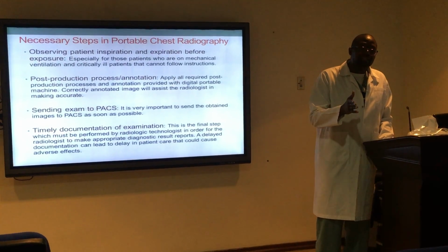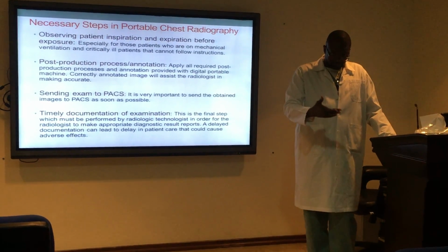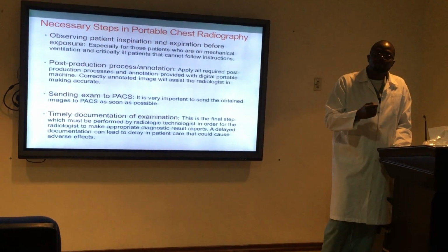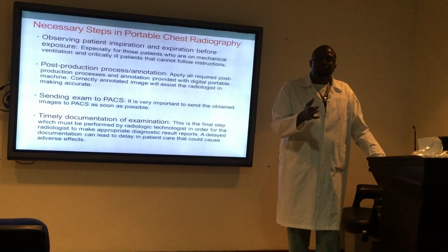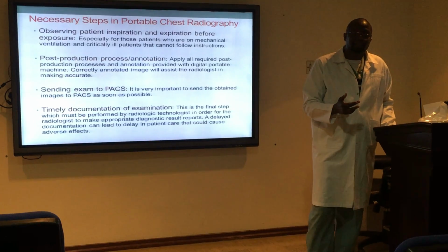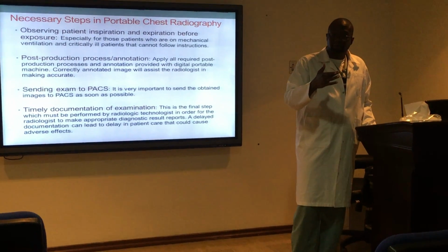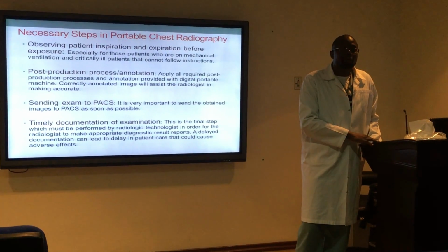Most X-ray exams are obtained when the patient has taken in a deep breath. With most portable examinations, it will be hard for you to give breathing instruction to your patient. Imagine you have to do an X-ray for a patient in ICU. The patient is on mechanical ventilation. So what do you need to do?